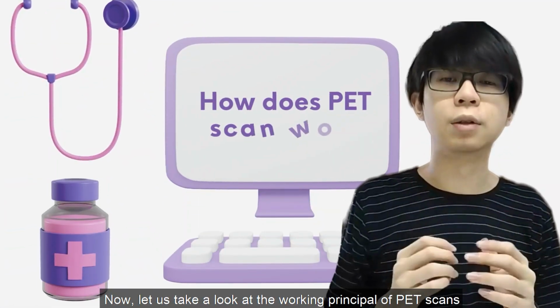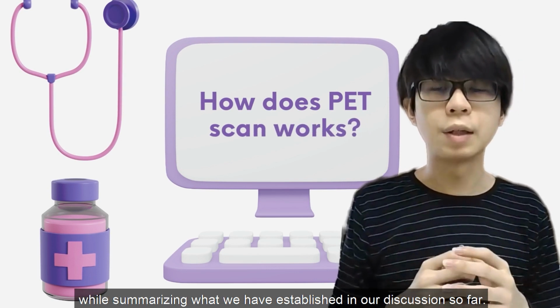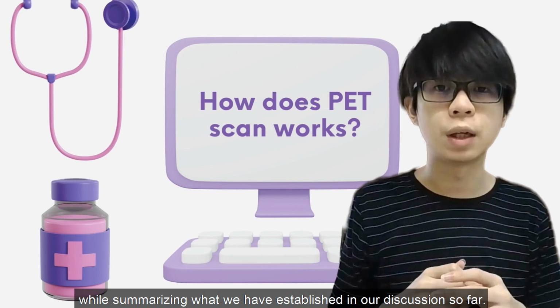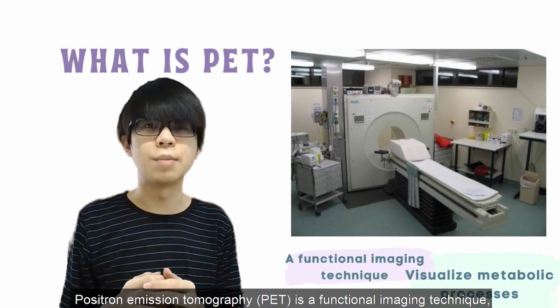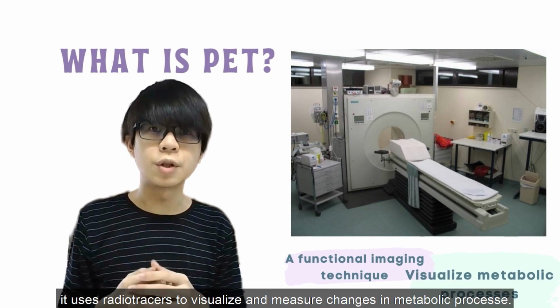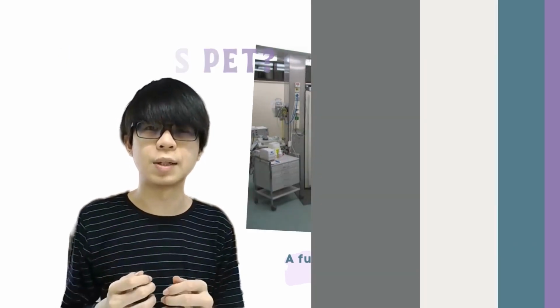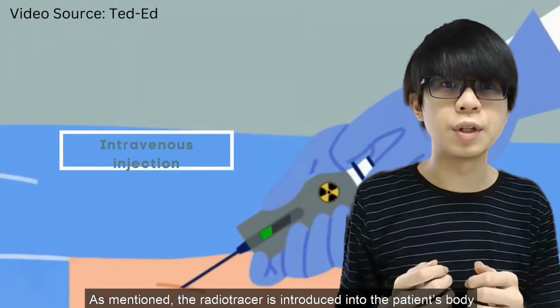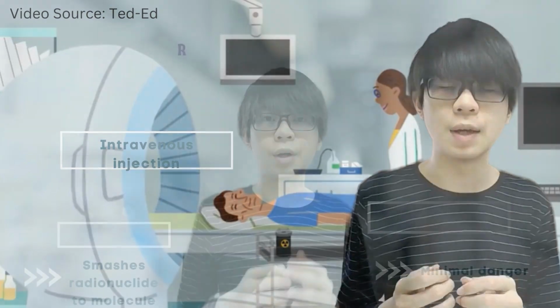Now, let us take a look at the working principle of PET scans while summarizing what we have established in our discussion so far. Positron emission tomography is a functional imaging technique. It uses radiotracers to visualize and measure changes in metabolic processes. As mentioned, the radiotracer is introduced into the patient's body via intravenous injection.